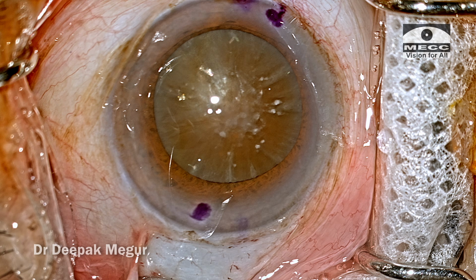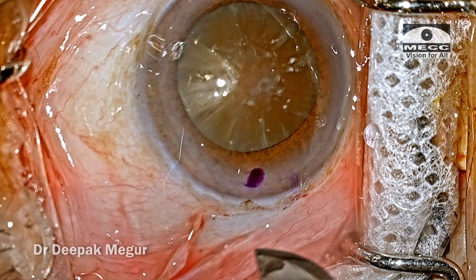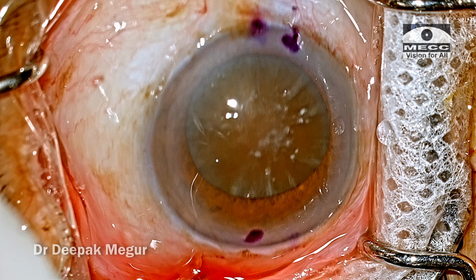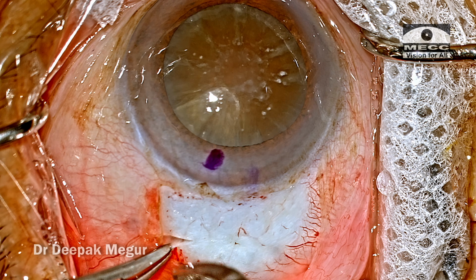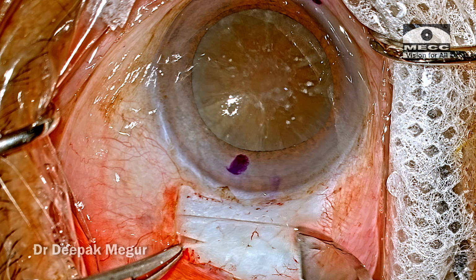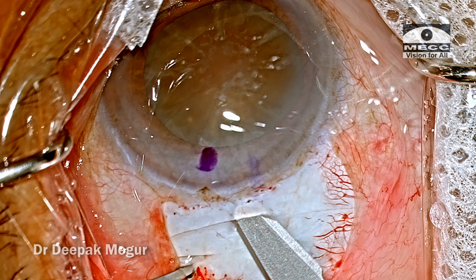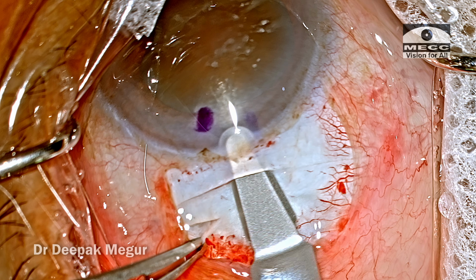So to stabilize the globe, I prefer to use a posterior scleral incision, which is about 2.5 millimeter in width. And it is placed exactly about 2 mm from your originally planned scleral incision. So I'm stabilizing the globe using this scleral groove with a limbus forceps, and a 7 mm long scleral incision is created, which is slightly frown in shape. The central portion is about 1.5 mm from the limbus. Using a crescent knife, the corneoscleral tunnel is being performed now.